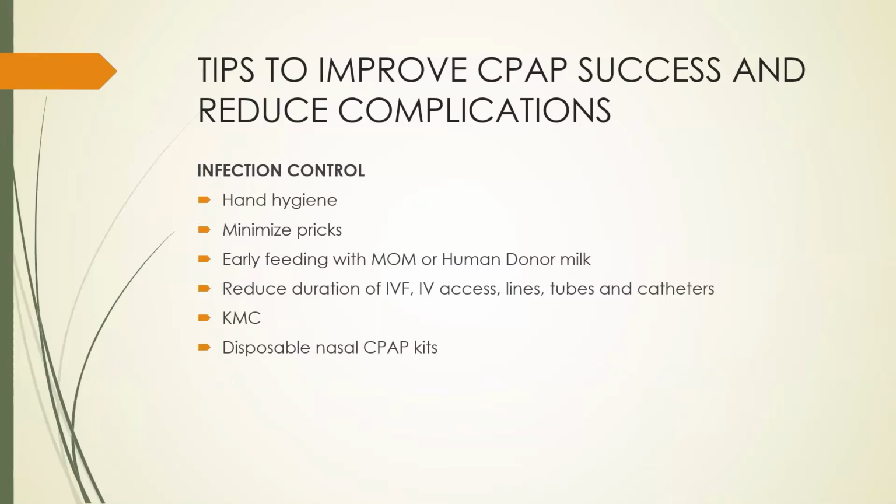Reduce duration of IVF, IV access, lines, tubes, and catheters. KMC is an important factor which prevents infection in the newborns. And disposable nasal CPAP kits should be used and should be changed after appropriate time.